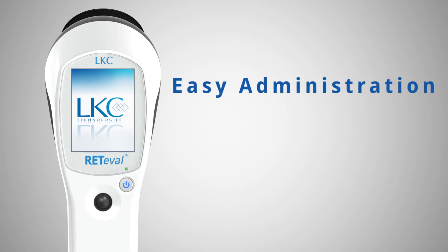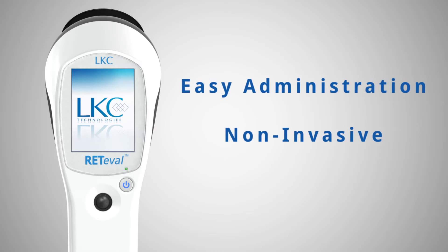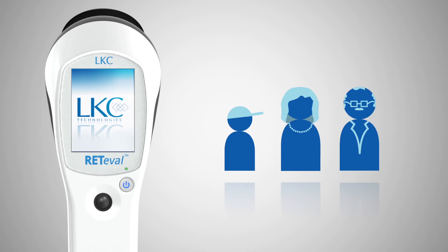Administration is easy for the doctor's staff. The entire process is non-invasive, taking just a few minutes per patient and yielding instant results. The test can be performed by the current staff with minimal training and disruption. The procedure is accessible to a wide population including those with cataracts and small pupils.